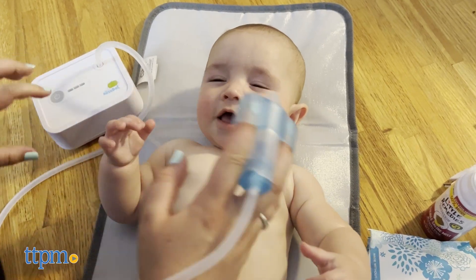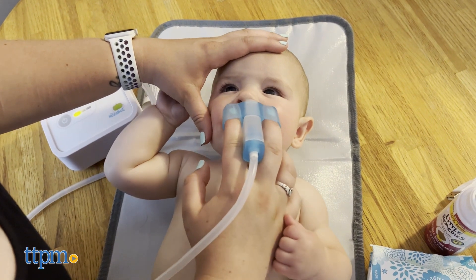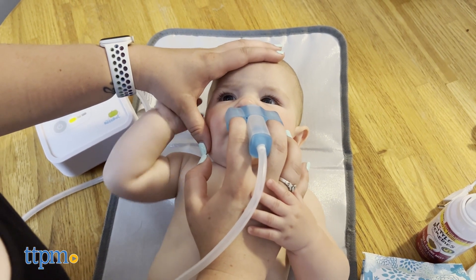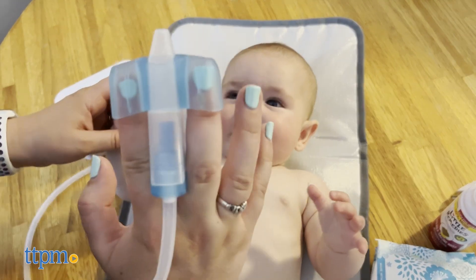It's also super easy to clean. The nose piece and tubing can be put in the dishwasher on the top rack. Plus, the filters are disposable. If you don't want to put the Nosebot through the dishwasher, you can also use a mild dish soap to wash all the parts. You can buy all new parts on the Nosebot website.